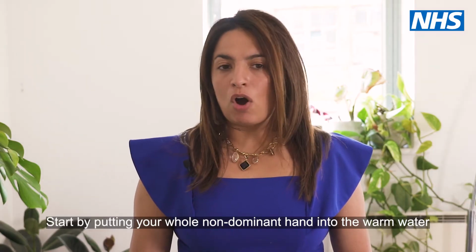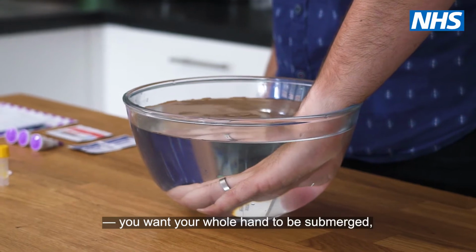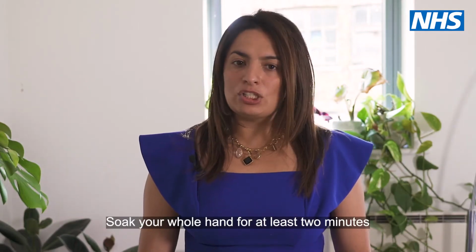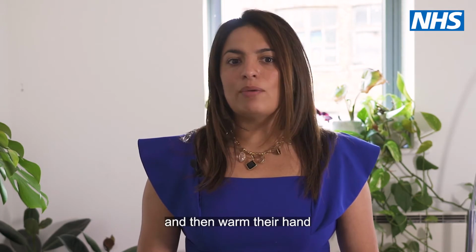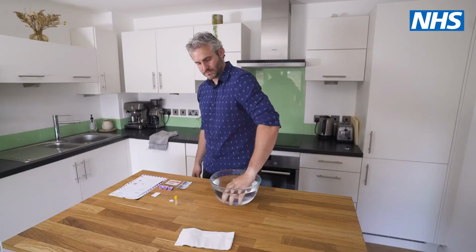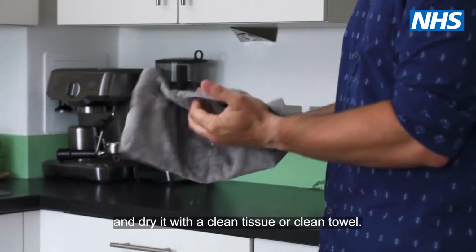Start by putting your whole non-dominant hand into the warm water. You want your whole hand to be submerged, not just your fingertips. Soak your whole hand for at least 2 minutes so that it gets nice and warm. Some people might like to start with a shower and then warm their hand, but it depends on how much time you have. Once your hand is nice and warm, take it out of the water and dry it with a clean tissue or a clean towel.